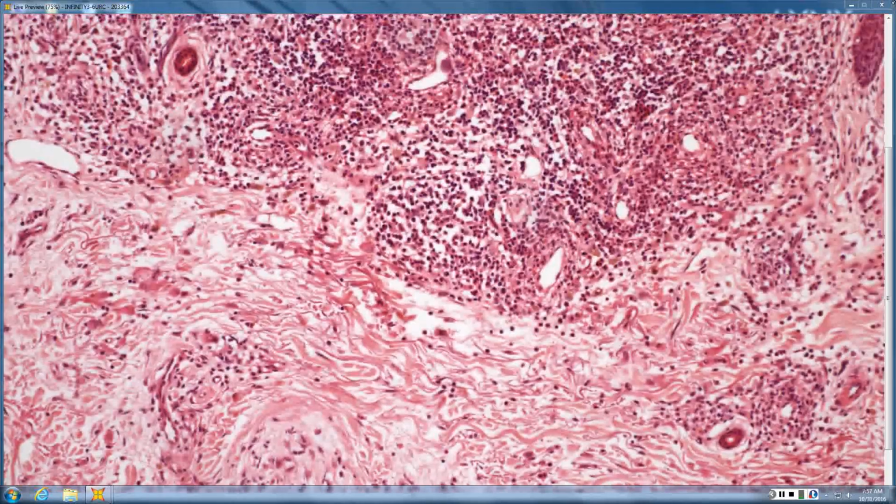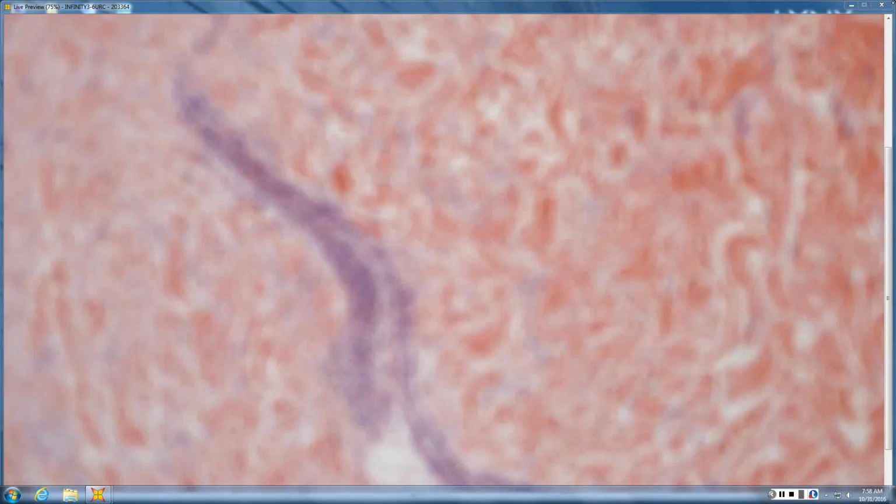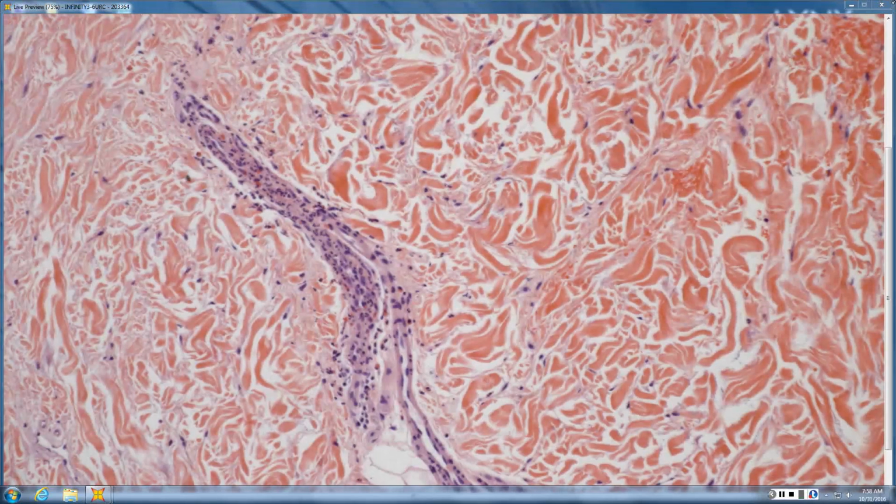So we won't find it. Yes, you won't find it because, other than in the name, you're not going to find granuloma in granuloma faciale. It's chronic perivascular facial leukocytoclastic vasculitis, but don't forget it's really common on the chest and back too. On the chest and back, you're going to see something kind of reddish brown. You're going to think Bowen's, but in retrospect, it looked just like GF. It was just that it was on the chest and back.